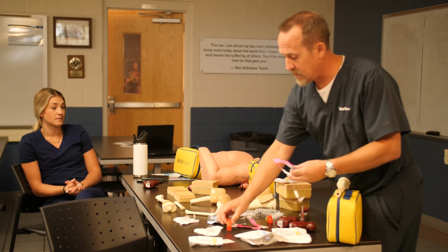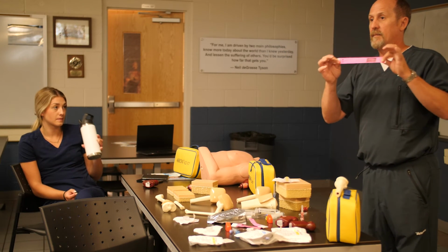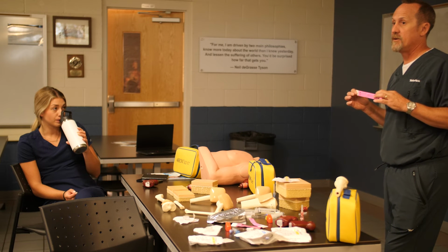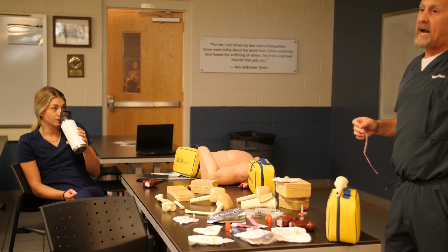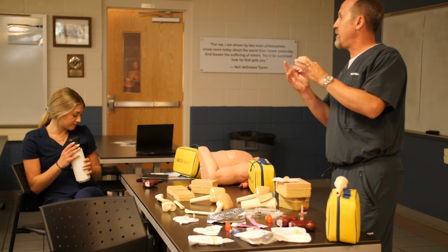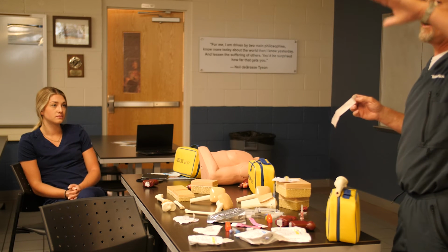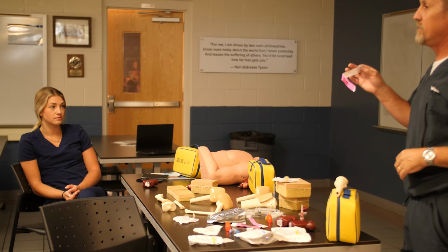So, to touch base a little bit on this pink bracelet, I mentioned that on an adult patient, we can leave this product in for 48 hours. On a pediatric patient, it's 24 hours. You guys are typically getting your patients, transporting them, and passing them off to a higher level of care, right? It's very important that when you place an IO, we put the date and time of placement on this bracelet. So if they go to the ED, they go to the ICU, as they go on through their continuum of care, everybody knows when it was placed, so we know when it needs to be removed, okay?